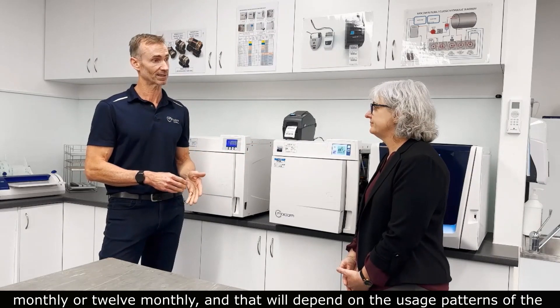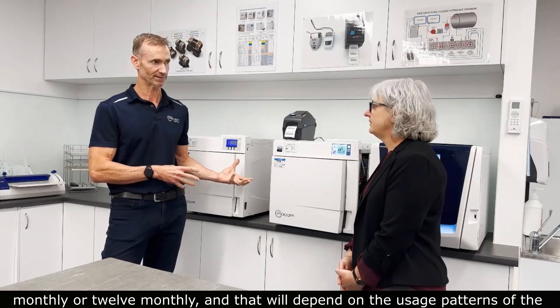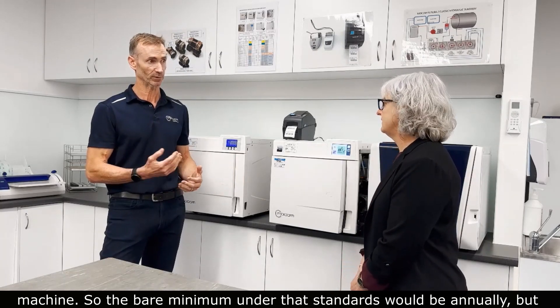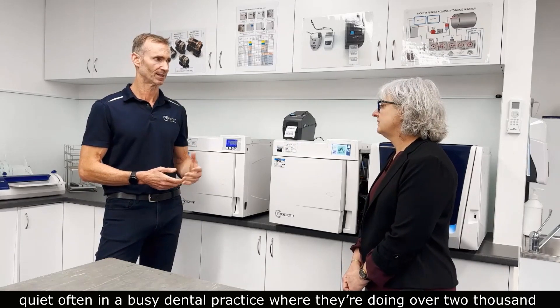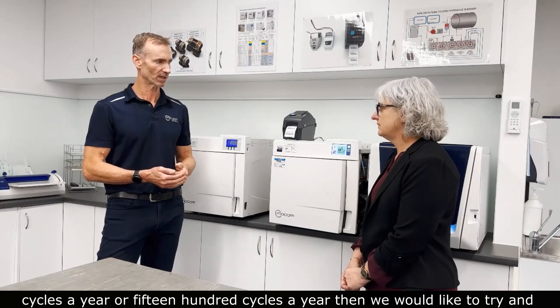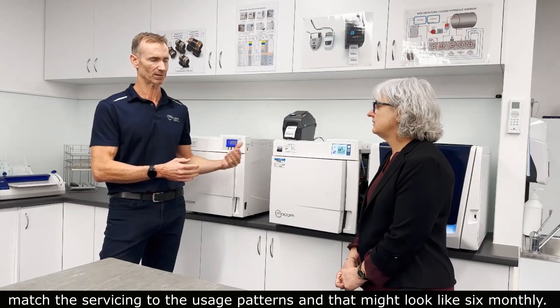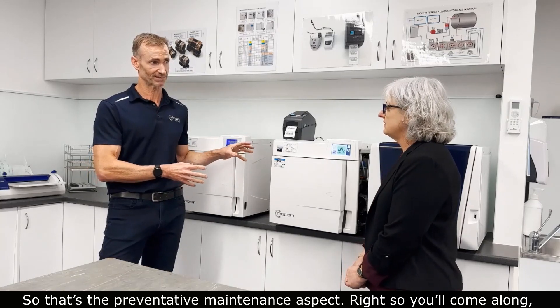We do that either six monthly or 12 monthly, and that will depend on the usage patterns of the machine. The bare minimum under the standards would be annually, but quite often in a busy dental practice doing over 1500 to 2000 cycles a year, we would try to match the servicing to the usage patterns, and that might look like six monthly. So that's the preventative maintenance aspect.